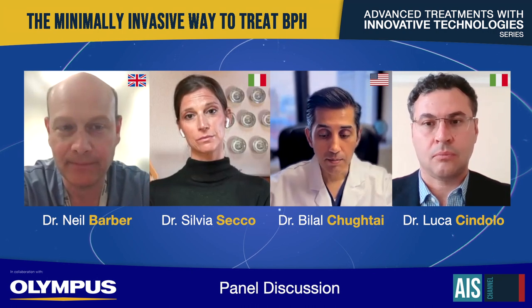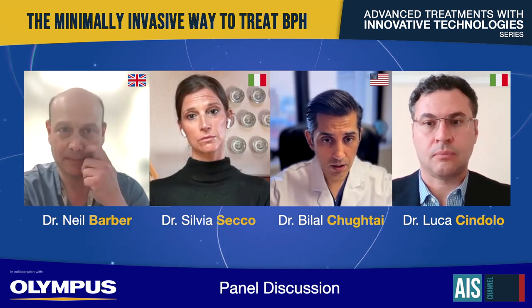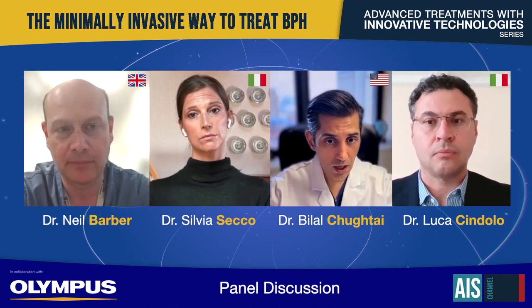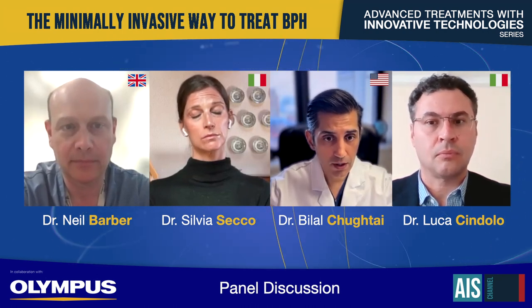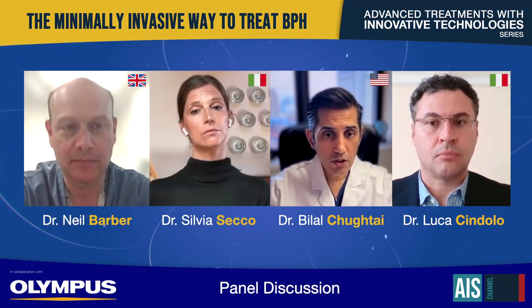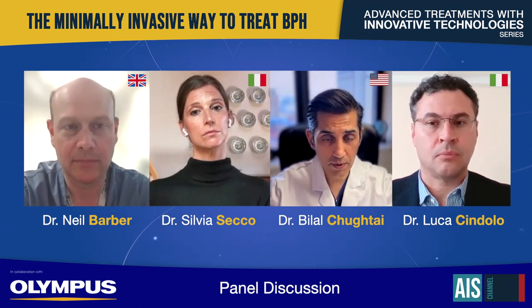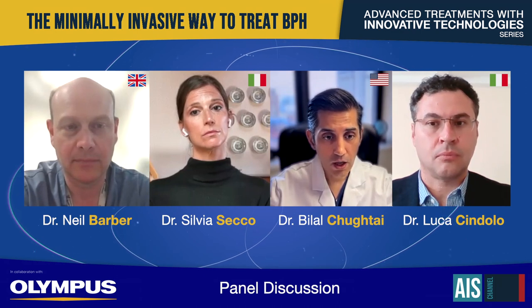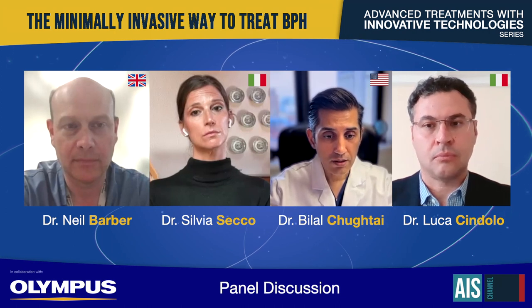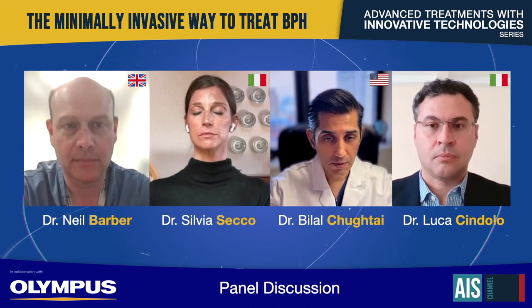Yeah, so I would say that when first starting out the procedure, doing it with a rigid scope definitely makes it a lot easier. I also think that the rigid scope also makes it virtually a one-person operation, right? You're able to do this yourself. An extra set of hands always helps, but you can essentially do it yourself. When you turn it to a flexible procedure, you definitely need a second set of hands. You definitely need extra equipment like a guide wire and a ureteral access sheath, which does add cost to the procedure. Right now in the US, it's not really covered in the office, so it's an out-of-pocket expense for the patient. So it does add some expense.